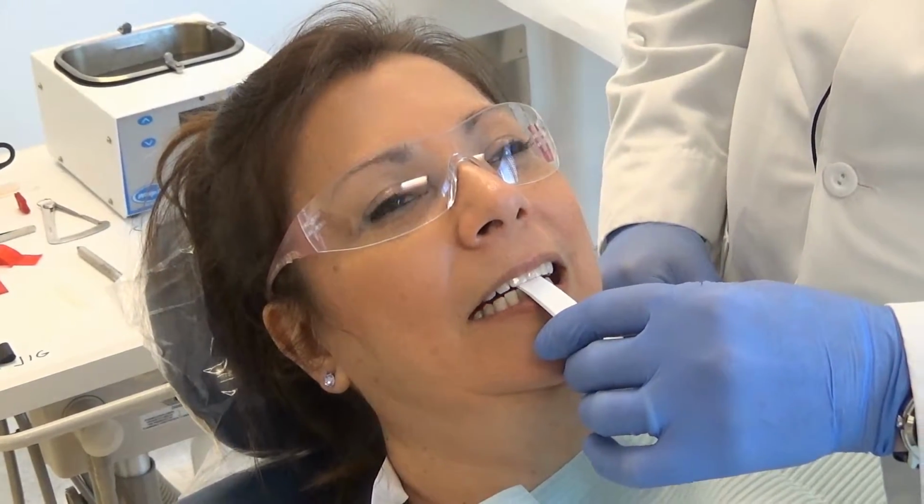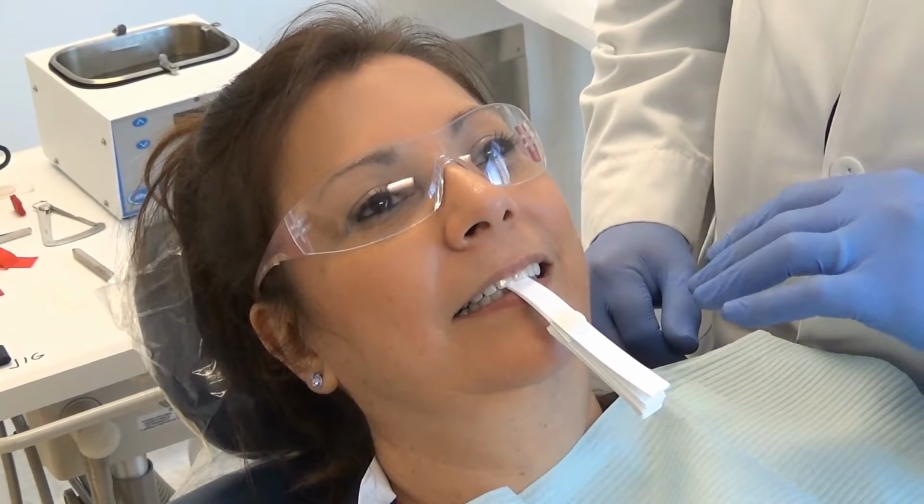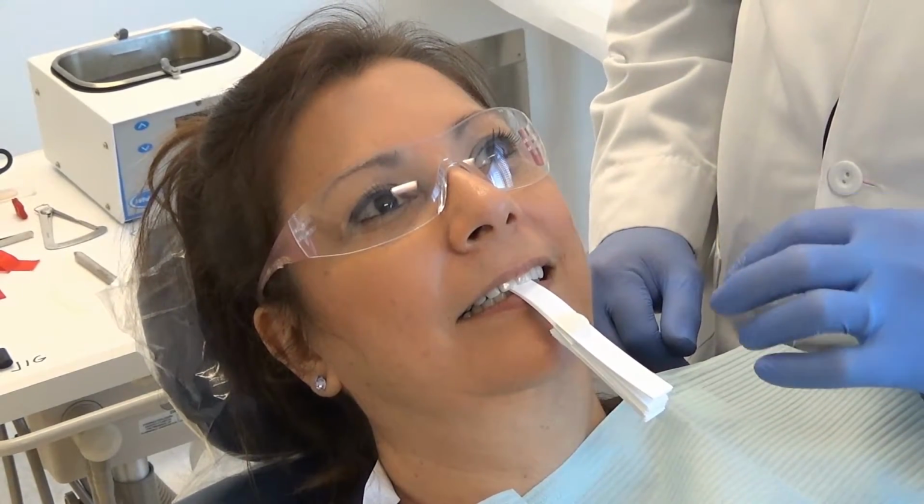Now we have a lot of leaves here that I just arbitrarily picked a bunch. Go ahead and open. Stay open, don't touch. I'm going to go ahead and count 10. And I'm going to save those and have her go ahead and close and bite. Do you feel anything touch in the back? Mm-hmm. Okay, so if she's not touching anything in the back, and this is 1 millimeter of clearance up front, she's probably pretty close to touching.